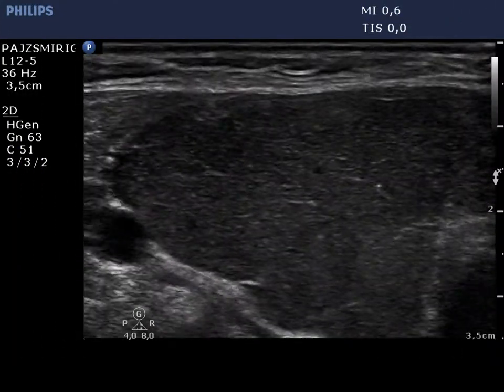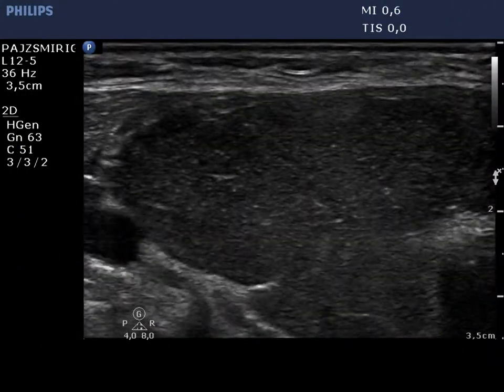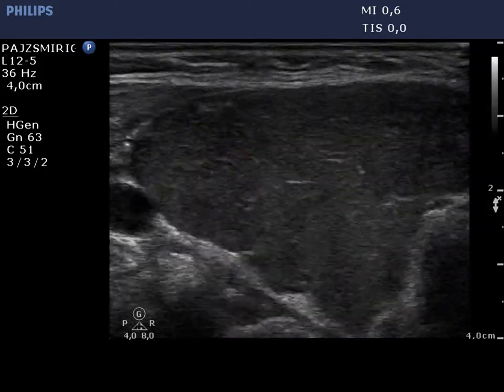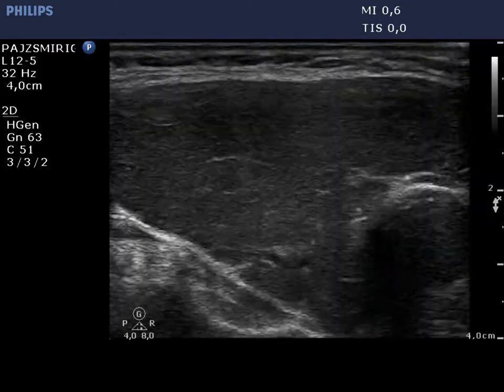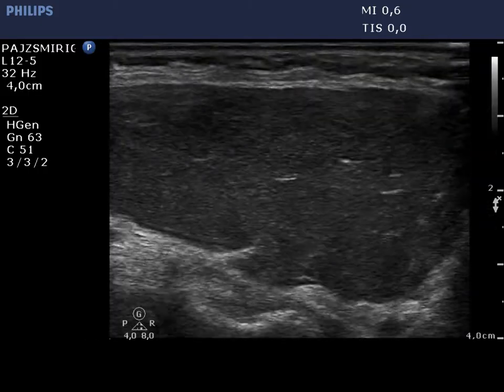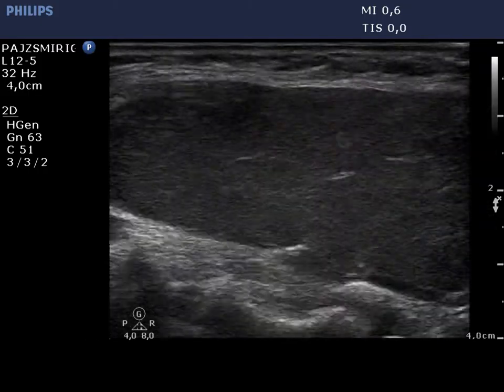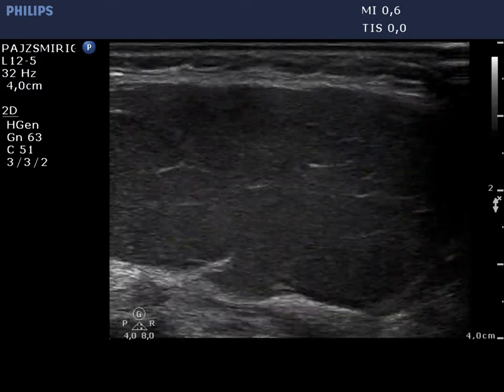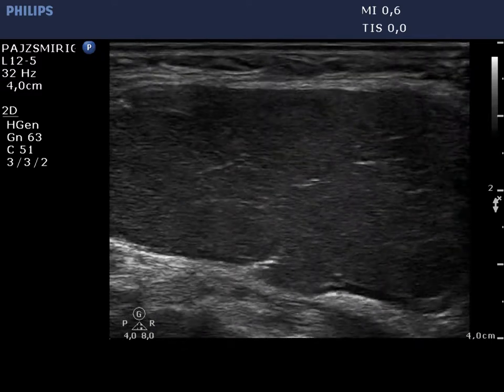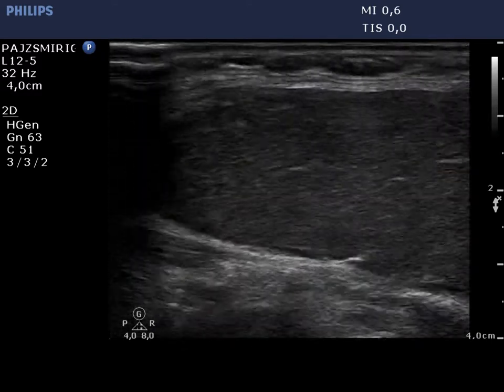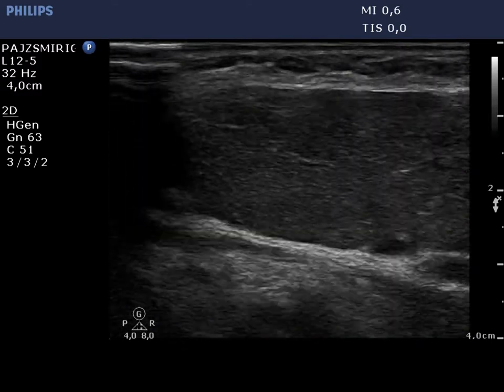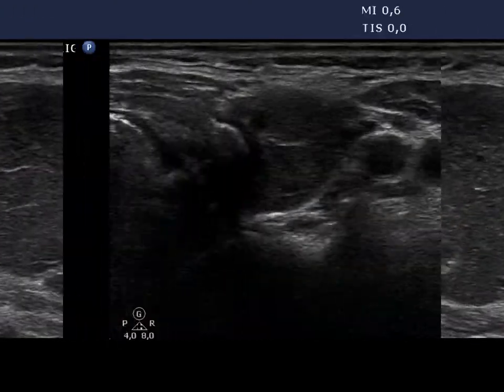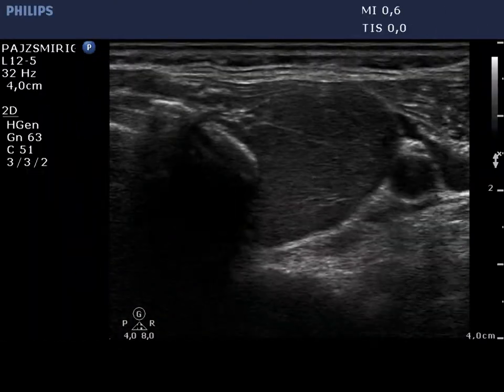In the video, first the horizontal view of the right thyroid, then the longitudinal scan can be observed. It is worth noting the presence of fine connective tissue, which is rarely seen in intact or nodular goiters. This fine structure divides the thyroid into subunits.